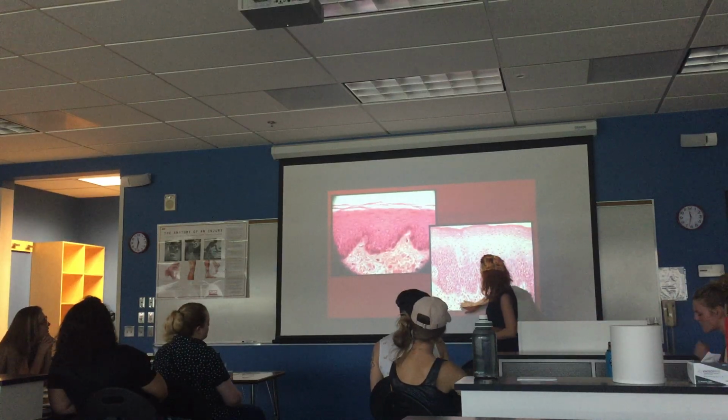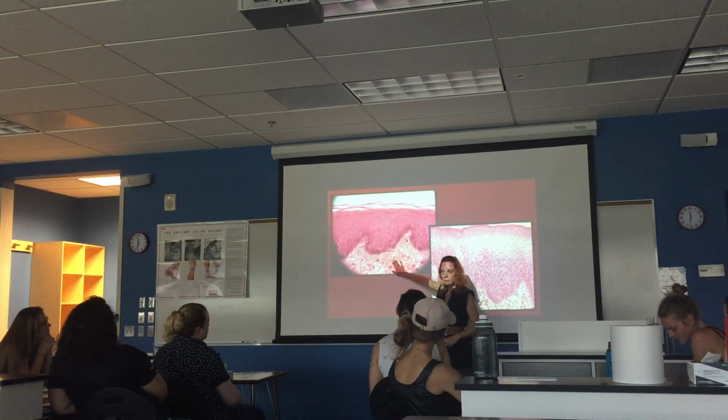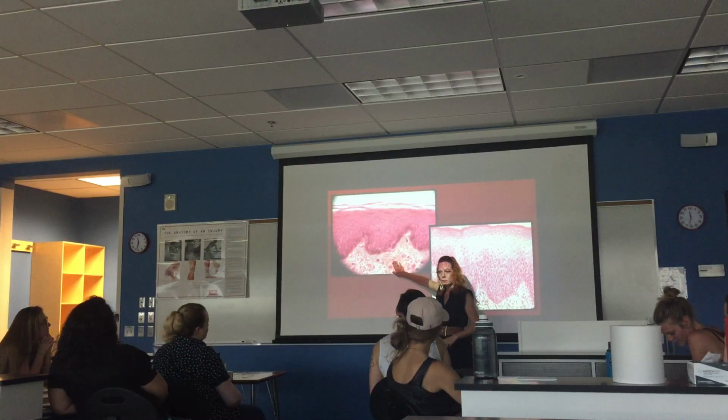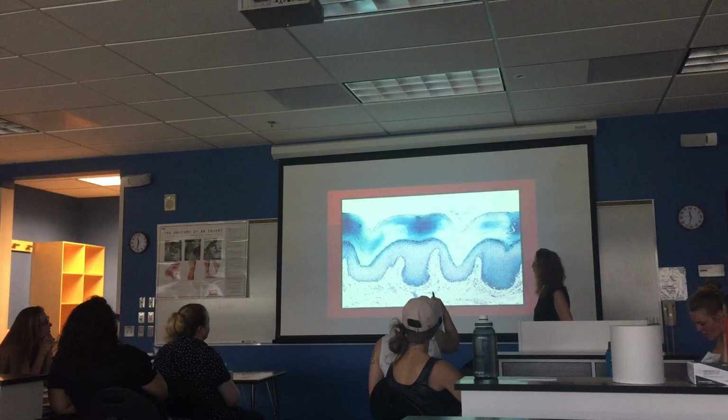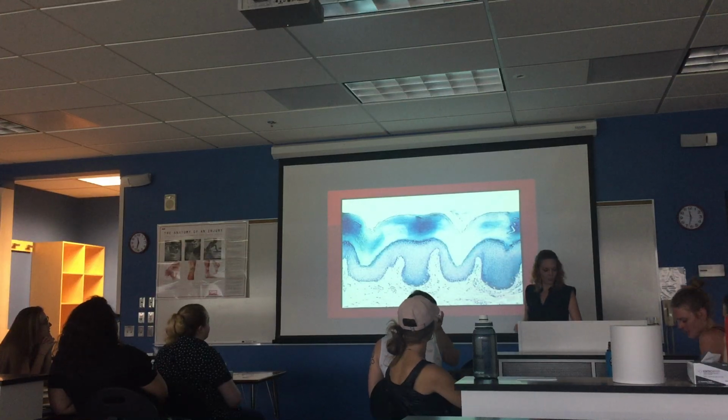Down here, good. And here's from the foot. That's kind of cool. Pretty.